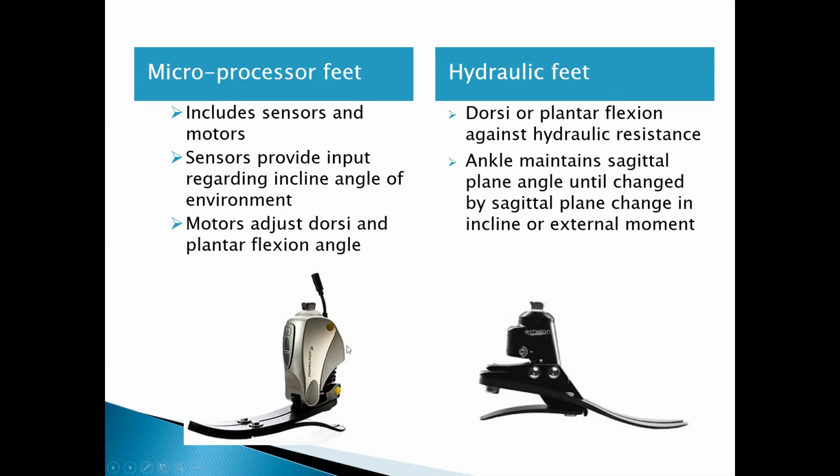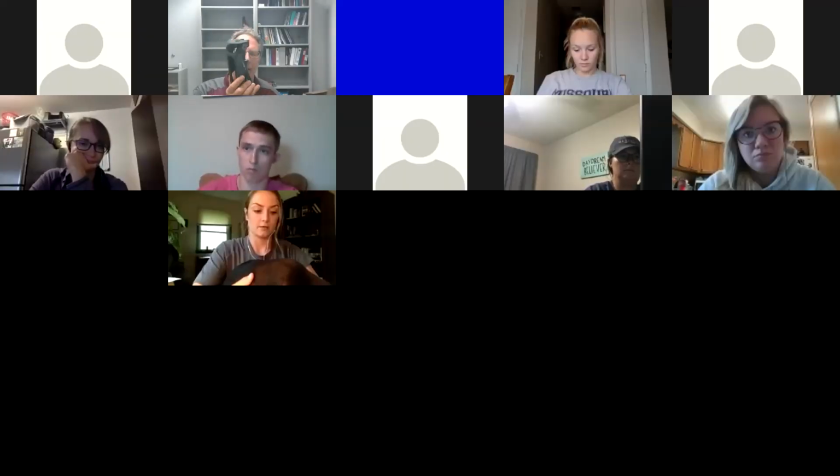Hydraulic feet don't have any motors, don't have any sensors, but what they do have is a hydraulic cylinder. And the good thing about the hydraulic cylinder, and I don't have a foot like this, but I've got a knee with a hydraulic cylinder, and hopefully I can get the idea across by using this knee. So make sure, again, you're on the speaker view, so this is big enough.